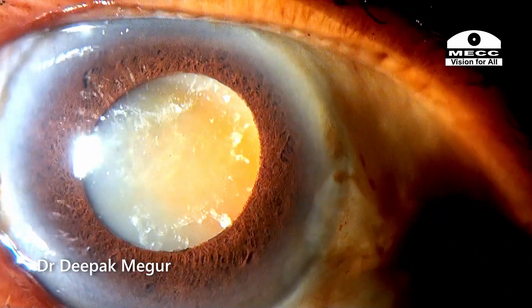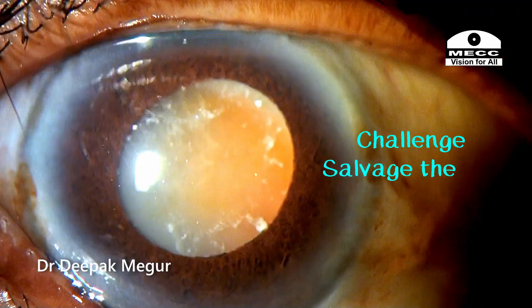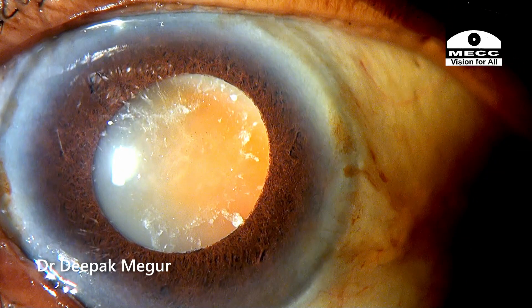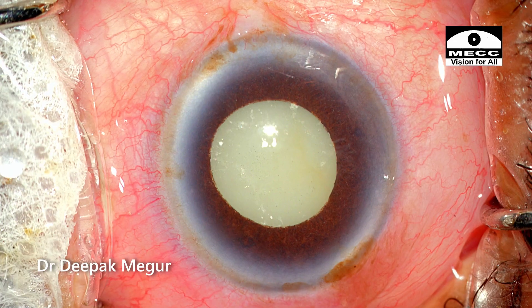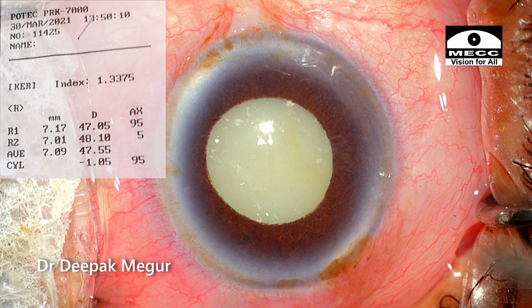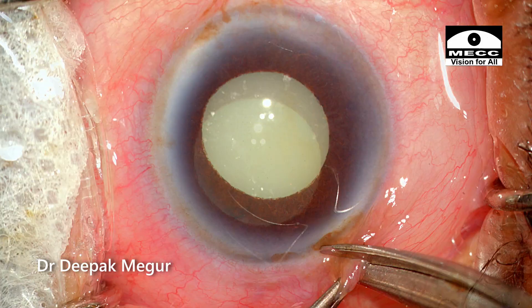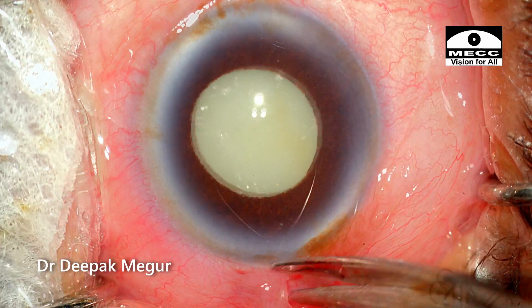The predominant concern and challenge in this case is to salvage the capsular bag and implant a posterior-chamber lens. The patient has a pre-existing against-the-rule astigmatism of one diopter, so I planned a temporal incision to counter this.